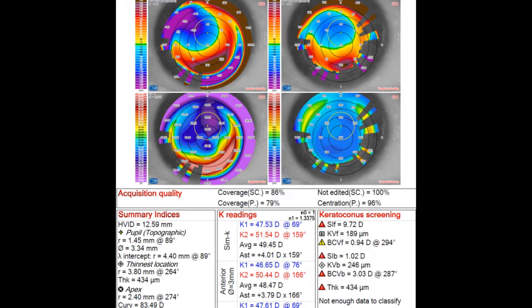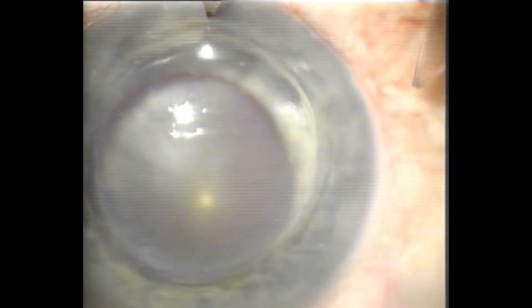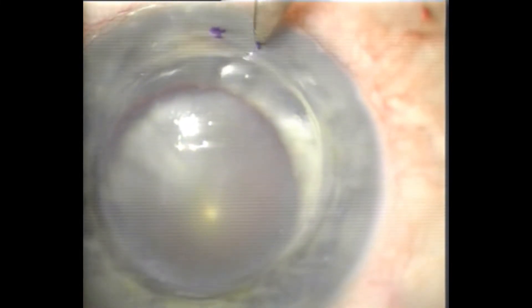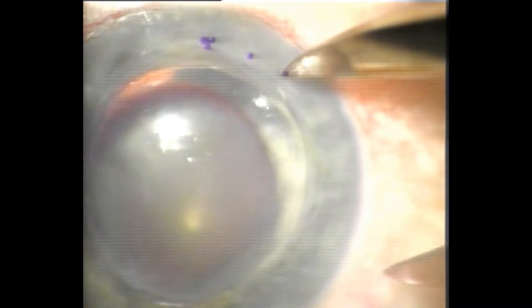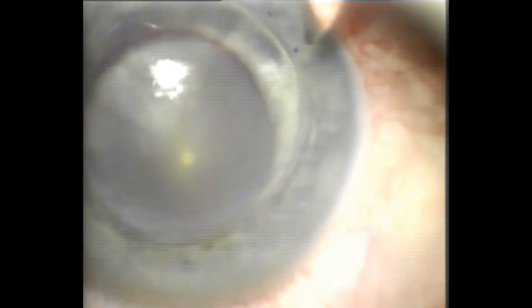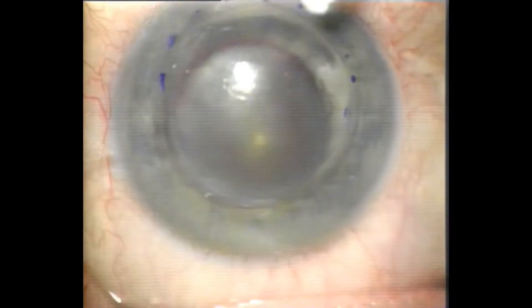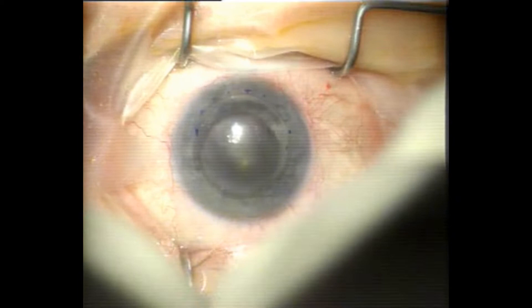This patient has developed graft-host junction ectasia, and you'll see in the two left-hand images the elevation and relative steepening inferiorly. I'm operating from 12 o'clock and marking the inferior area of ectasia with the calipers and some ink, and then I'll use a trephine later to give me a guide for the incision. I don't commonly need to do this surgery, but it is a fairly common problem and often the solution is to replace the graft.